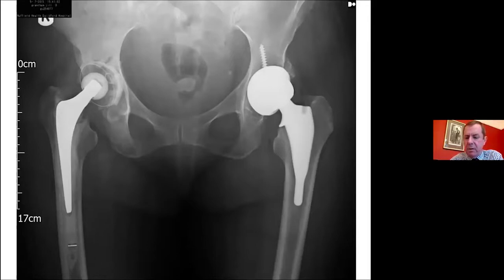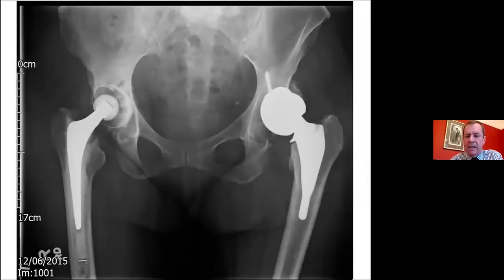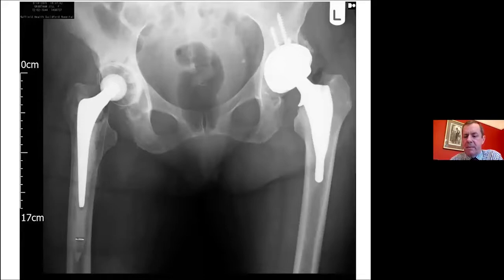She strictly complied with that for most of the time, but she had four steps up to her toilet and thought it would be all right to go up those with no rail and no support four times a day. And at 7 weeks, she looked like that. I revised it to the same. There were no signs of infection, and this time it worked.